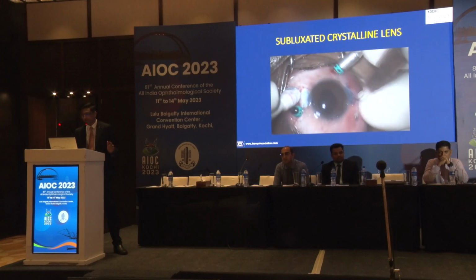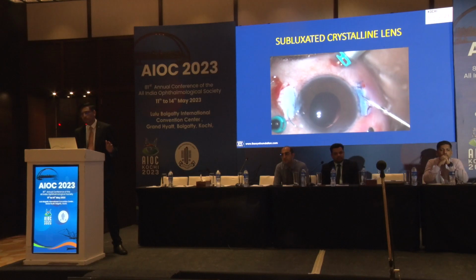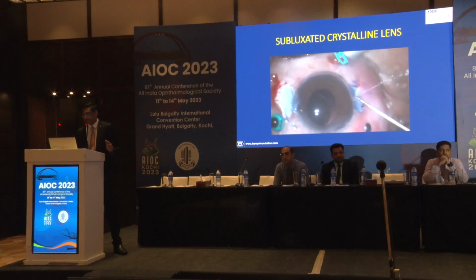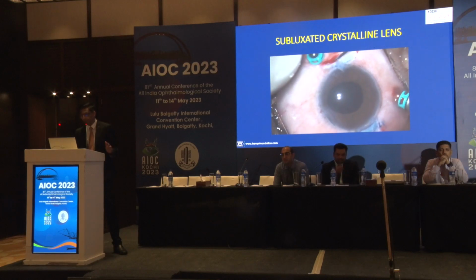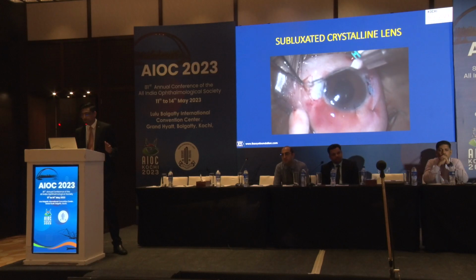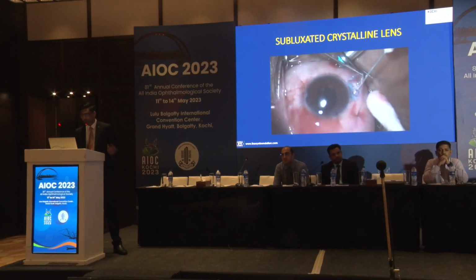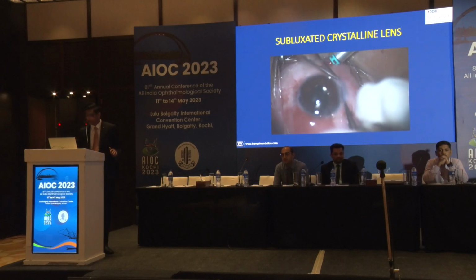And this is the Scharioth tunnel, which will help you to fixate without needing any additional equipment. Once you exteriorize the haptic and nudge it into the tunnel, you can close it with the glue.